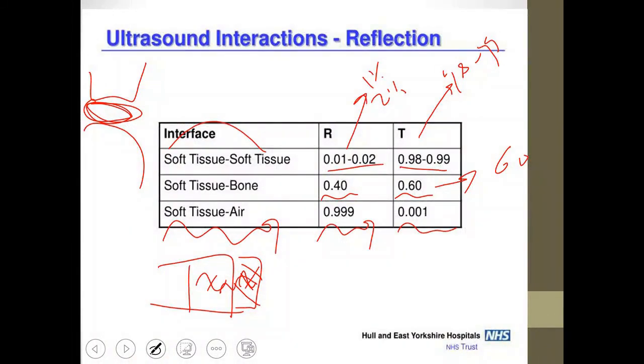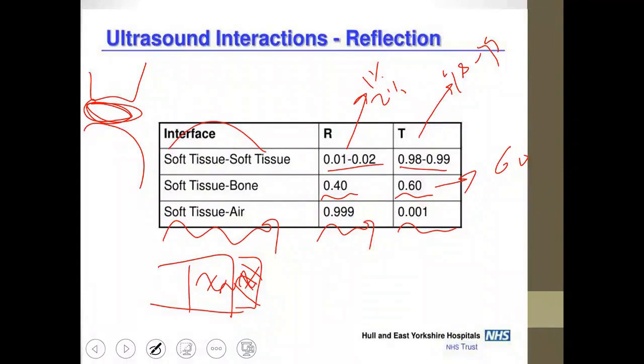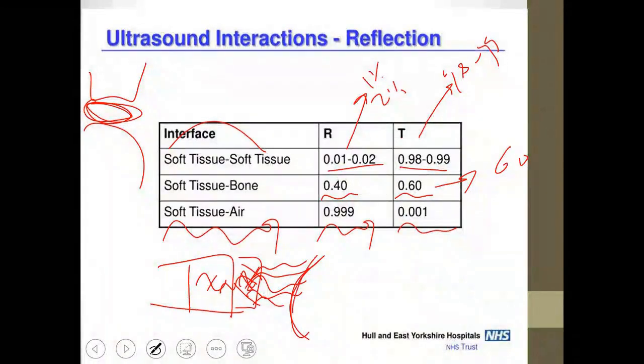This is because if the impedance of the backing block material is different, it will reflect back again and return again to the crystal. I don't want that. I want it to disappear because I only want the ultrasound that came from the crystal and went into the skin.